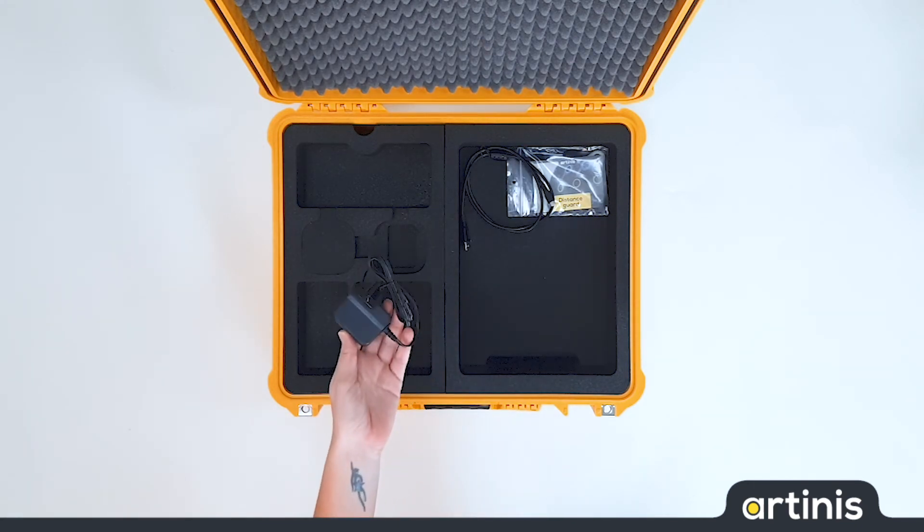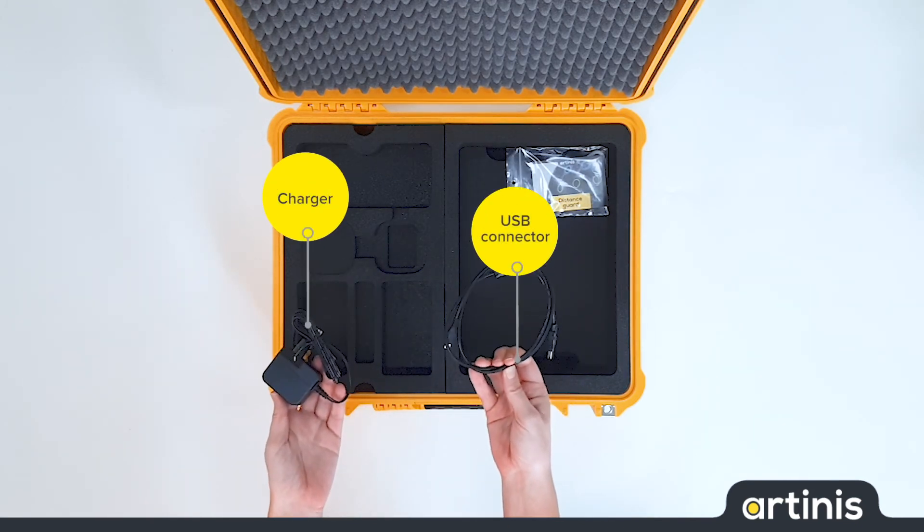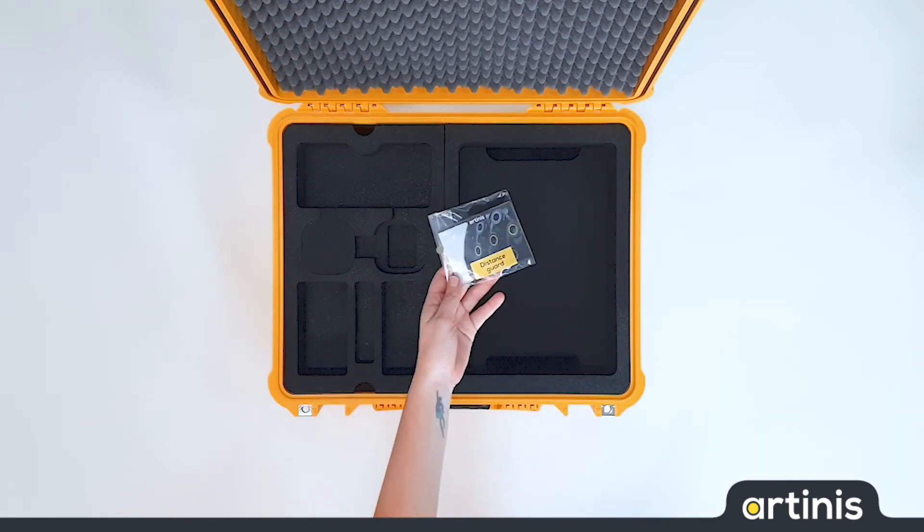Then we have a Bright charger and a cable to connect the Bright to the laptop. Next to that we included some small items to make your measurements easier, such as the distance guards.